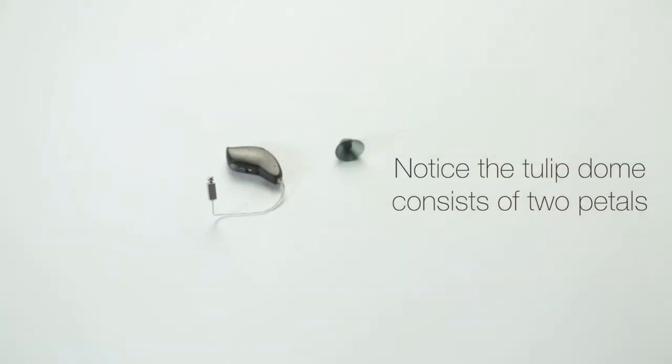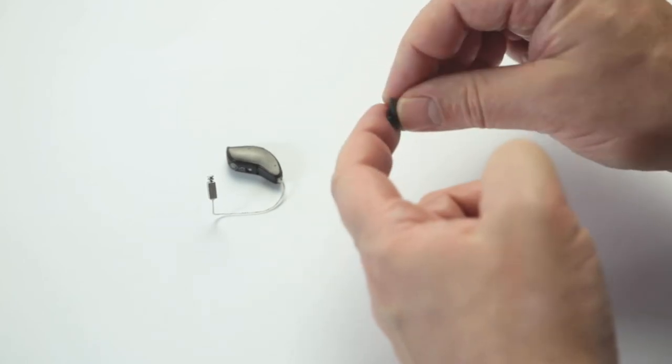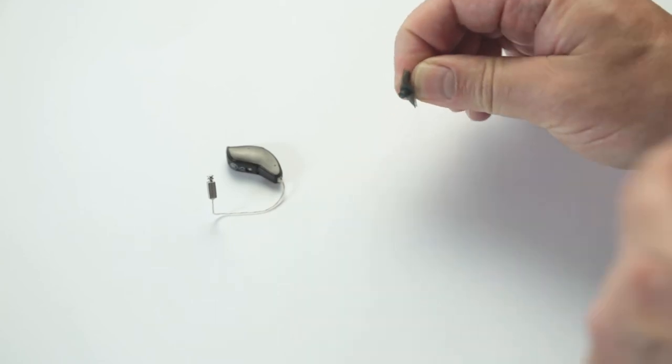Notice the tulip dome consists of two petals. Hold each petal between your index finger and thumb, and slowly bend one of the two petals forward.